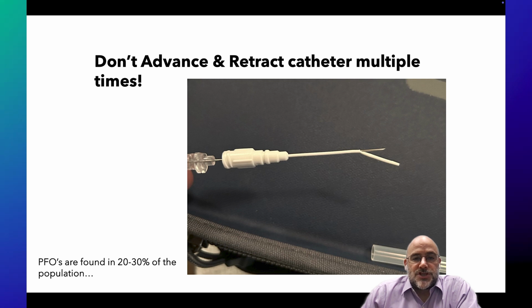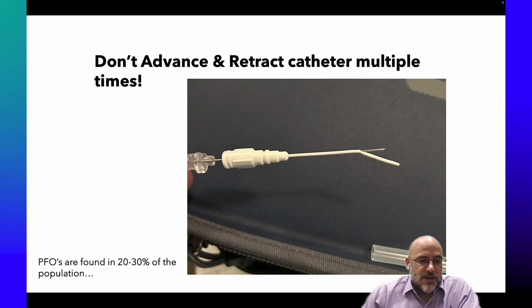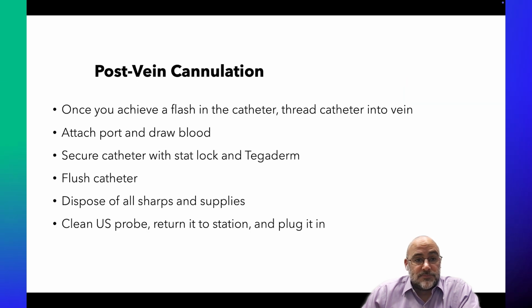So you don't want to shear the end of your catheter off and sort of embolize that down to the patient. So if you advance and it fails, don't pull back and try again. As tempting as that is, just be prepared to abandon that catheter and choose another one. So that has to do with your setup.